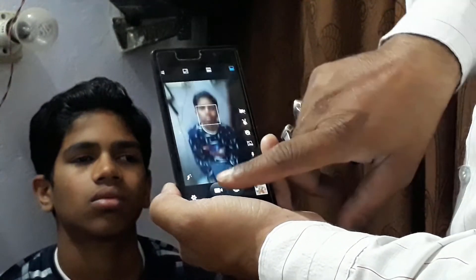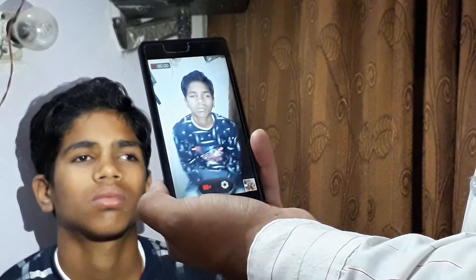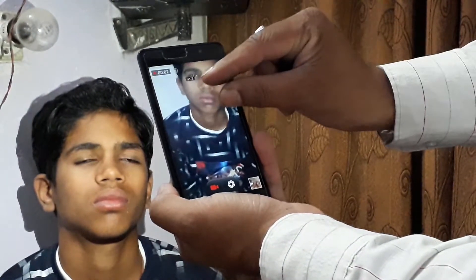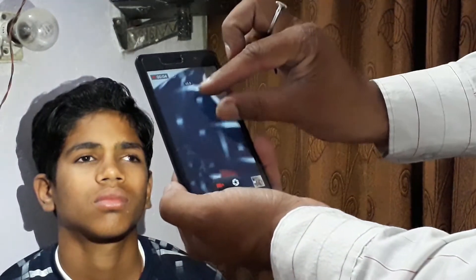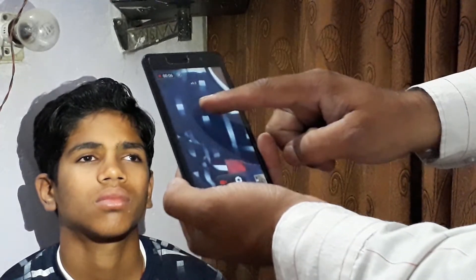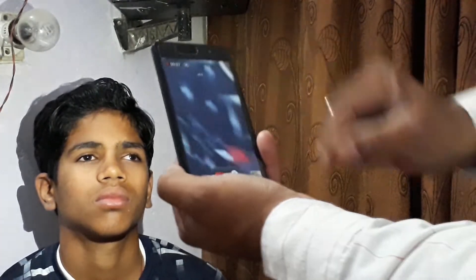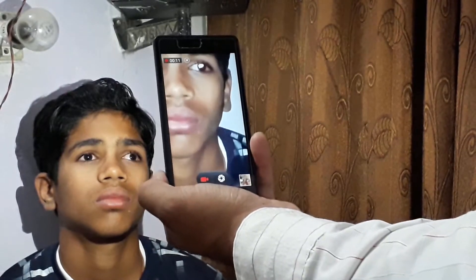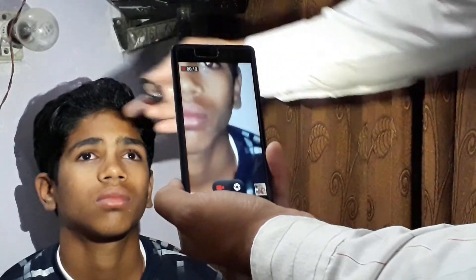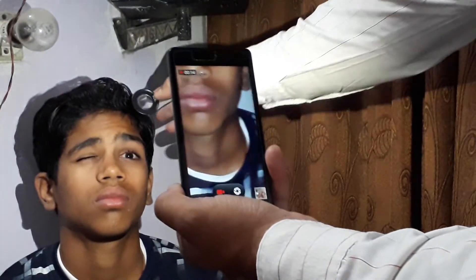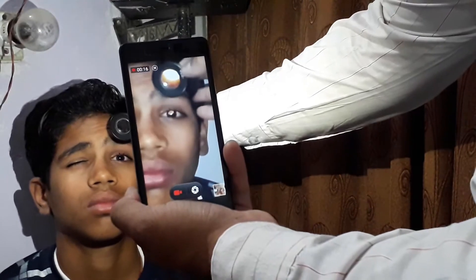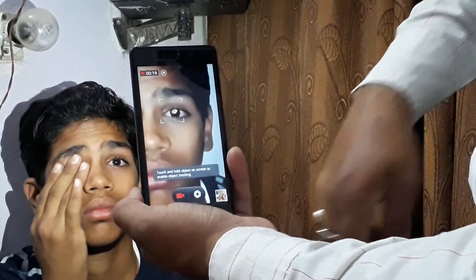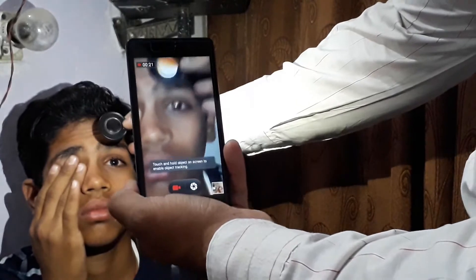Now switch on the video recording and you can see the red reflex, or red eye, in the camera. Zoom in the camera as much as you can on the target eye, and place the 20D trial lens in front of the eye which has to be examined. Adjust the distance between the eye and the 20D trial lens until you get a full, clear image of the retina.